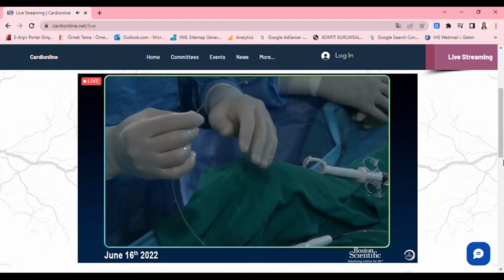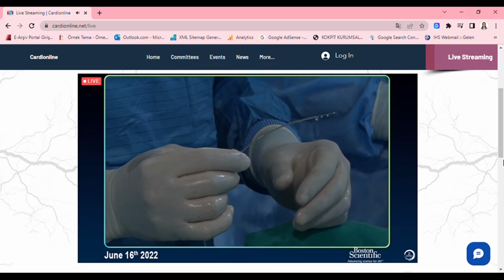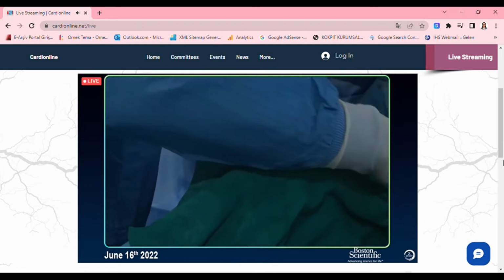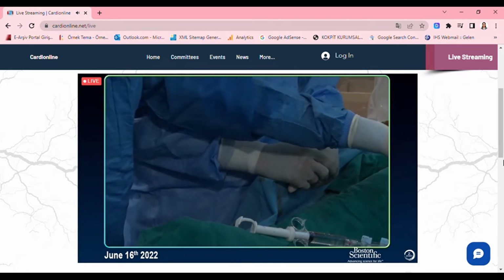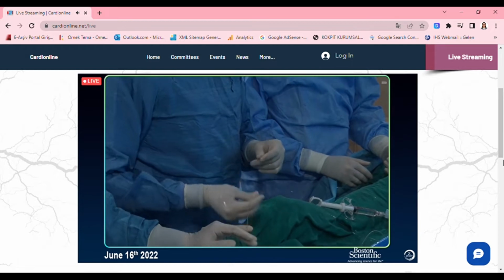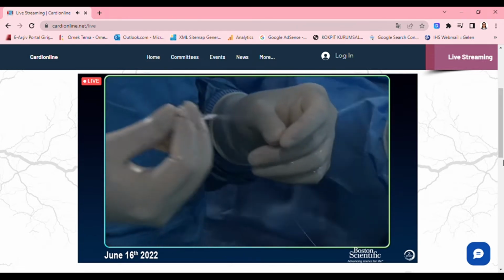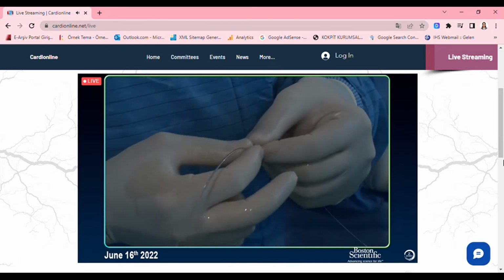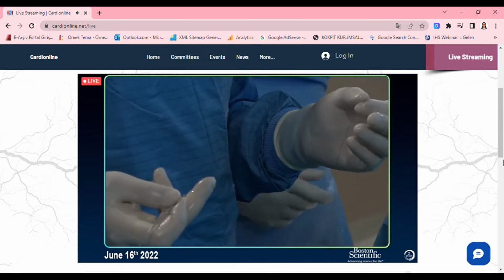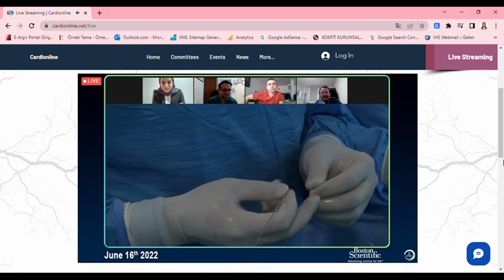Professor Omar, before you move on, just quickly, Dr. Asad mentioned a good thing, that we usually use the Rotaglide. That's already a done solution for you in the US, but in the Middle East, you do your own. Do you do your own solution? No, we don't use a specific fluid for that. But since I heard it from Esad, I am doing it now in all my procedures, and I don't know how helpful that is. But since then, I haven't encountered any stuck wire in the rota. So I think it might be somewhat helpful.